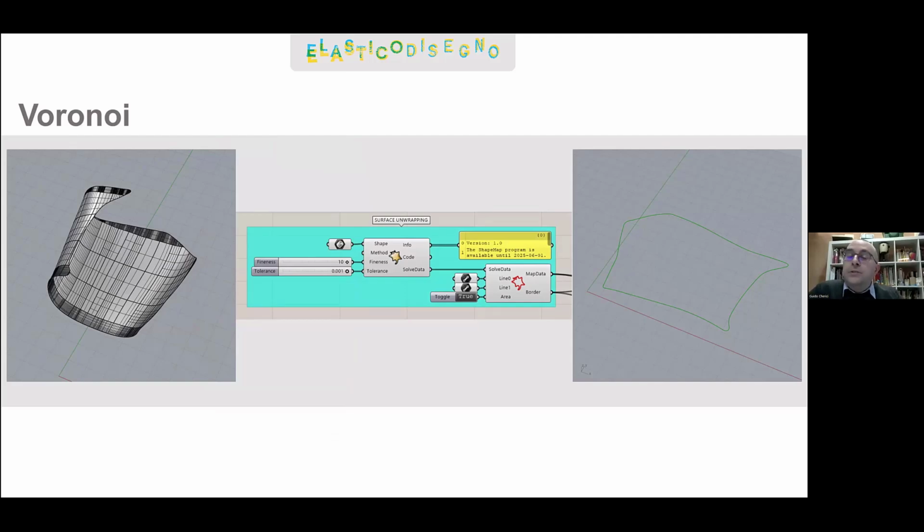for the next cover we used a Voronoi pattern, which doesn't provide enough protection for everyday use, but is widely used for industrial applications. In this case, we went back to the actual surfaces of the covers that we designed, and we created a surface that sits exactly in between the outer and the inner side of the cover. So while in the previous one we had a single surface, here this is a polysurface made of like 100 different little surfaces stitched together.